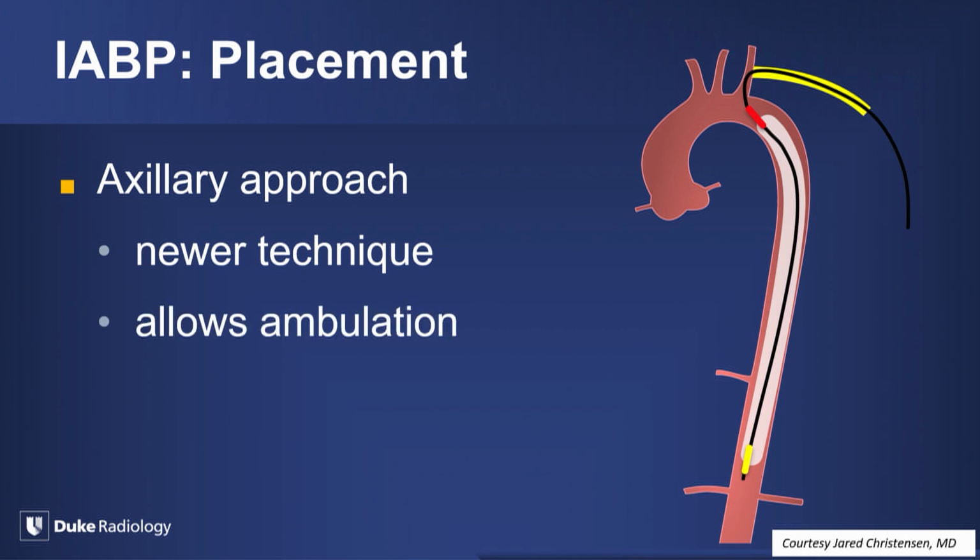Well, they're nice for longer-term therapy because they can hook the patients up to portable pump packs, and they can ambulate while they're waiting. And these are often used as a bridge to transplant, or sometimes when they're trying to decide on an LVAD or that sort of thing, so they can get the patient up and moving around. So they're useful for longer-term therapy.